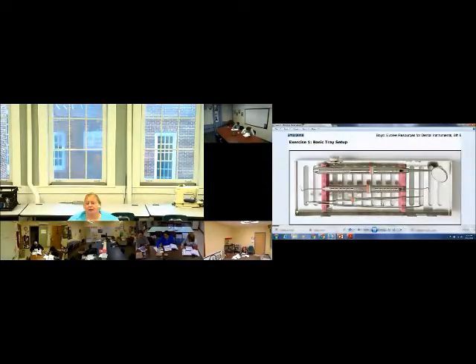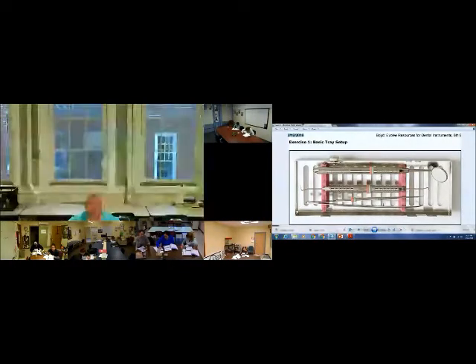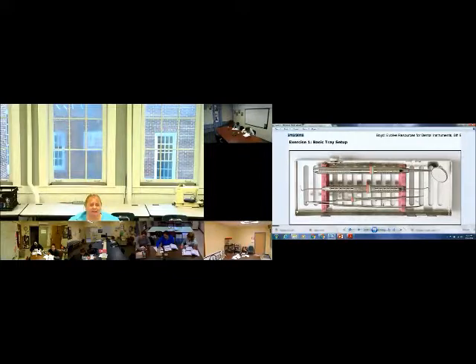Basic setups are on every tray for every procedure. So there are no procedures that don't need a mirror, explorer, and a cotton plier. So you will always have a basic set out. Now some offices package the basic together. So the mirror, explorer, cotton plier are in one either cassette like we see here.